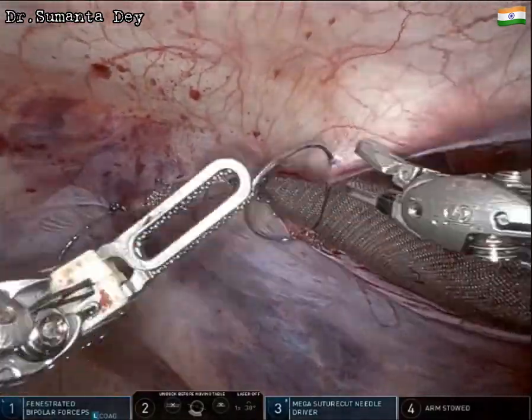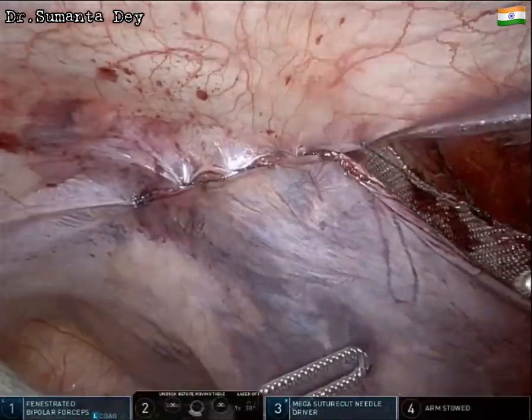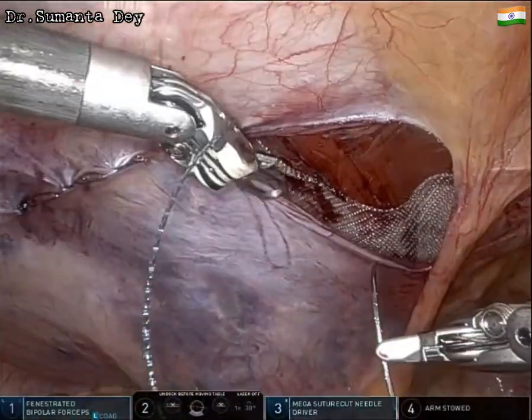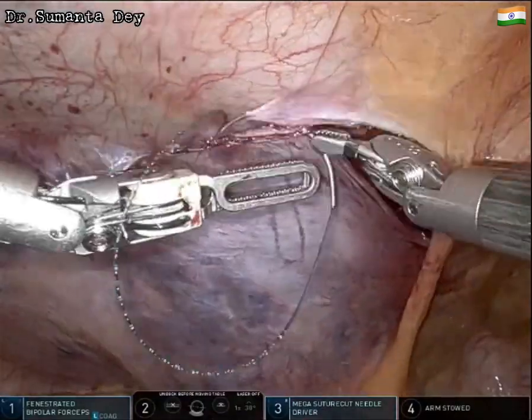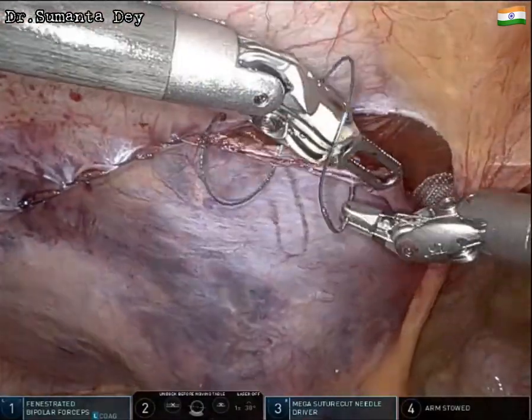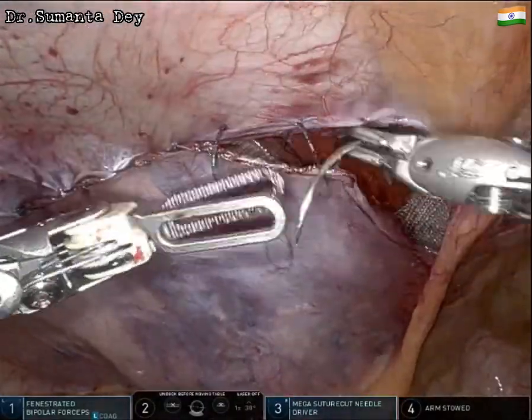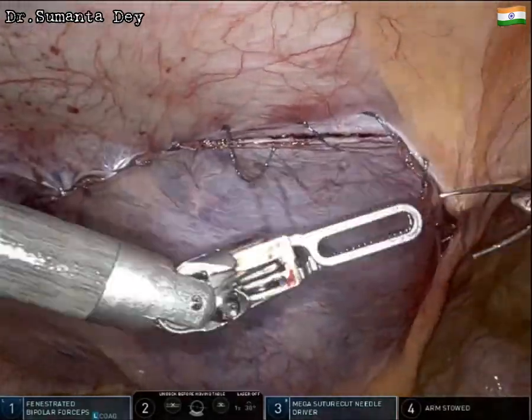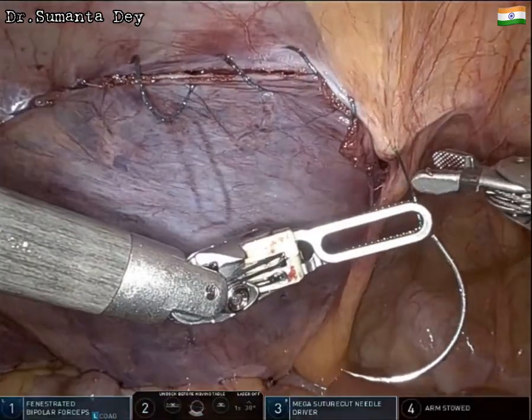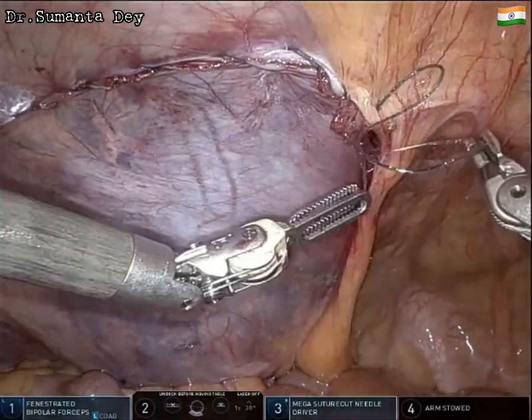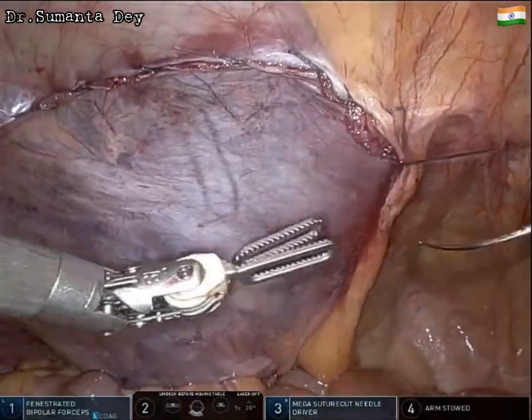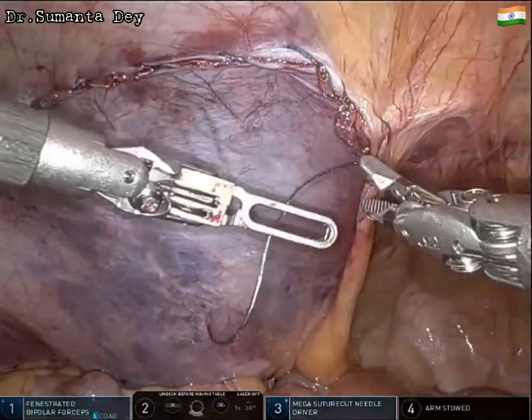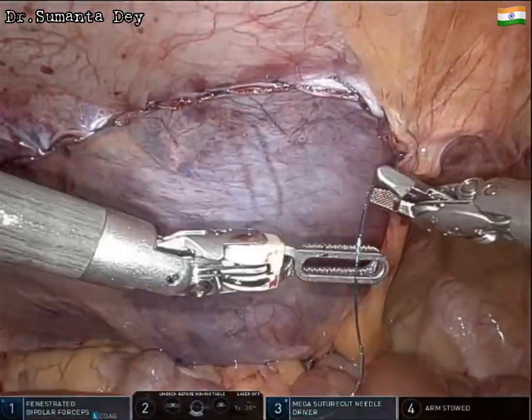Continuous suturing with 3-0 absorbable V-Loc suture is performed for peritoneal flap closure. Before deflating the pre-peritoneum, all gas is evacuated from the pre-peritoneal area so the peritoneum adheres to the mesh. The patient had an uneventful recovery and was discharged on the first postoperative day.